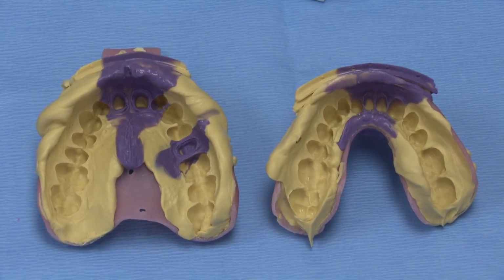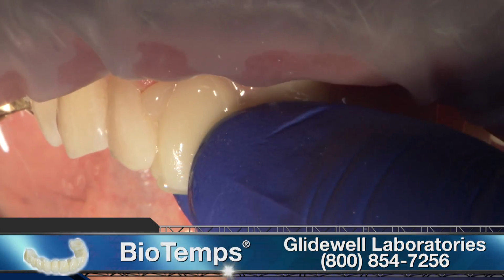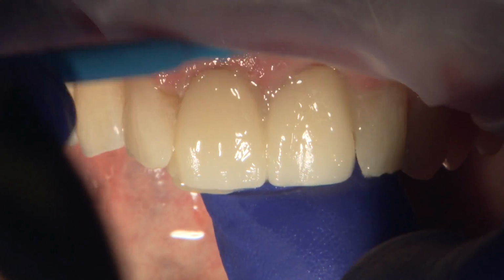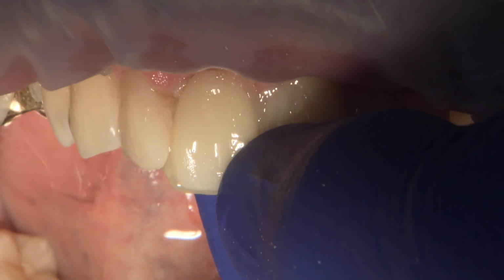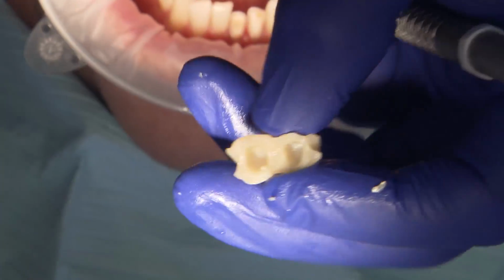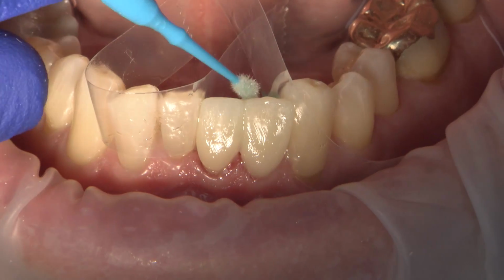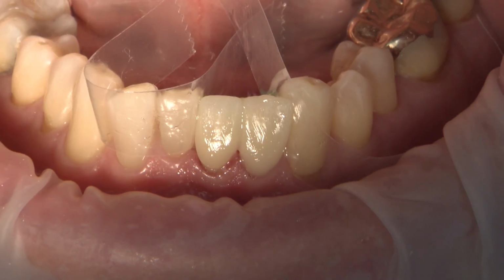Based off of our digital wax-up for these teeth during the planning process, we were able to have some Biotemp CAD shells fabricated to serve as our provisionals. Our assistant Will Schmidt is now relining the Biotemps with a bisacryl temp material that will both chemically and mechanically adapt to the internal surfaces of the Biotemp restorations. Once it's set, the excess flash is carefully removed with an acrylic burr down to the margins to ensure that we have a nice seal.